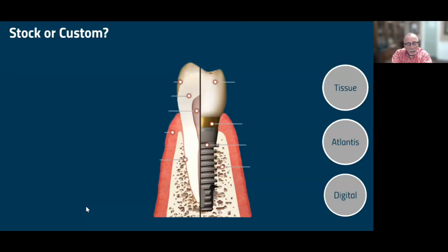And when we go outside of those boundaries, that's when we start to see the patient show up with the recession and the bone loss. Now, I'm not going to say that 100% because certainly patient care has a lot to do with it, but I think we need to set the foundation by building the platform exactly how it needs to be.